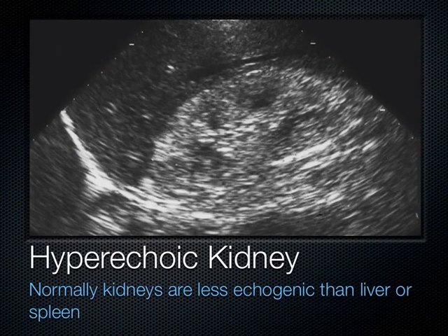Now moving on to the abdomen, there are lots of ways we can diagnose infection in the abdomen. I'm going to start here with the genitourinary system, and we're going to talk about the kidney. Now, pyelonephritis: this is the kidney here. You're used to seeing it much less echogenic, but this is what a kidney looks like when it's infected or has pyelonephritis, which is normally a very clinical diagnosis. You pound on the patient's back, they've got some CVA tenderness, and pyelonephritis is diagnosed with that and an infected urine specimen. But here we see a kidney on ultrasound that looks very hyperechoic, and we see this commonly.